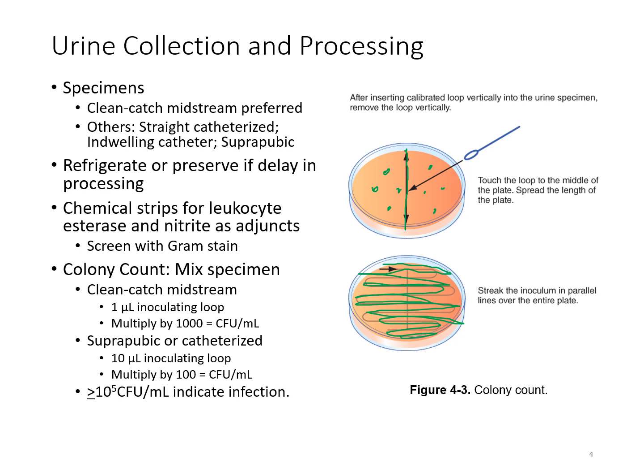Now, the facility that you're at will have the criteria for what they're going to call, such as if there are multiple organisms, they'll let you know. If it's greater than a certain number of organisms, then we consider the sample contaminated. They will also set the criteria for things like if there are more than 10 colonies present, then you would work it up. If there are less than that, say you only have 1 or 2 growing, then you might not work it up. But they will set that criteria, so be sure that you're reviewing that criteria for your particular lab.